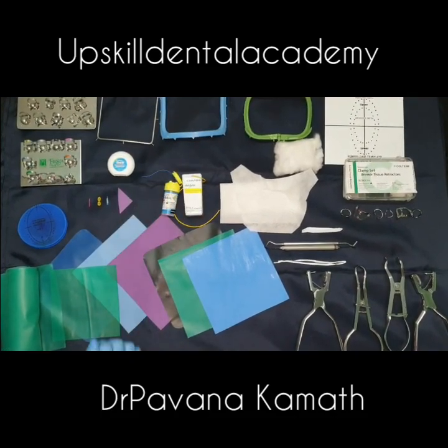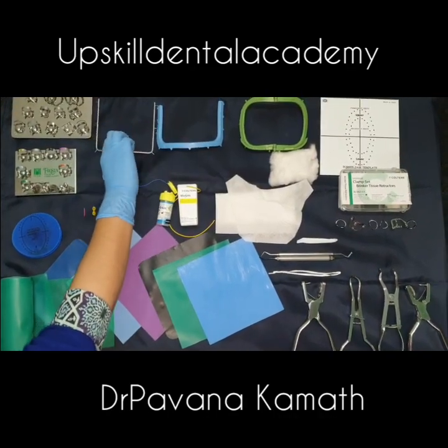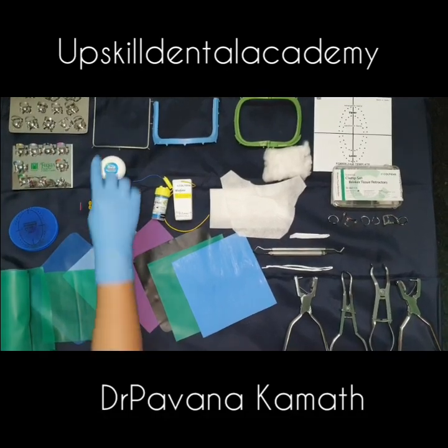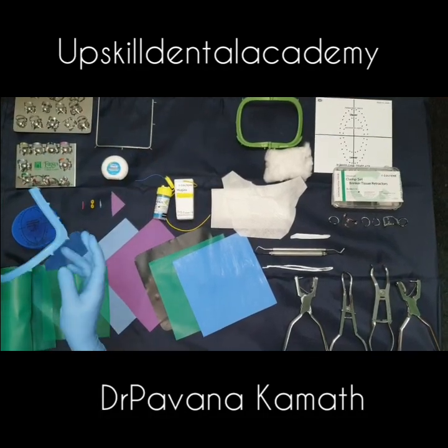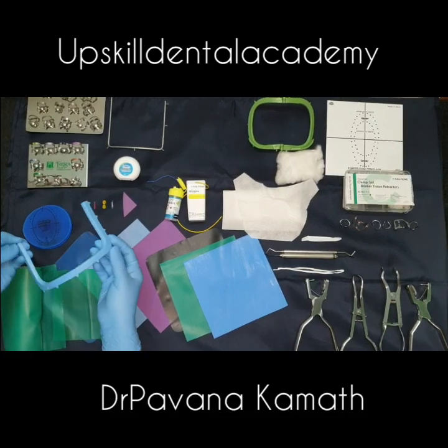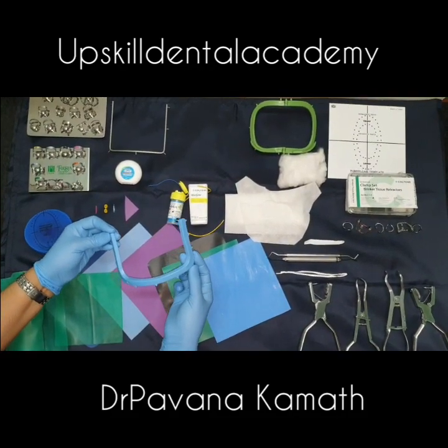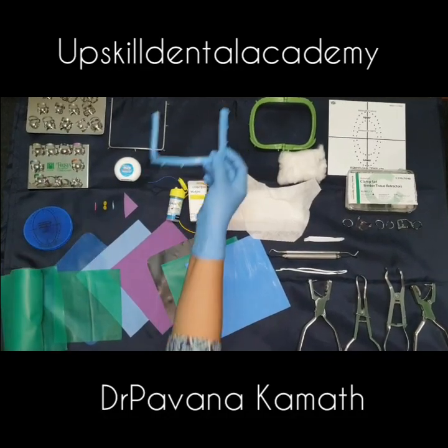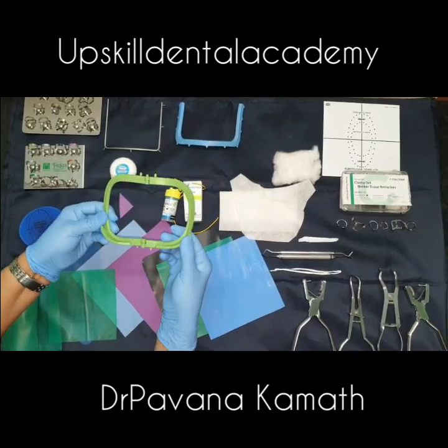Then we have the rubber dam frames. This is the most commonly used metal Young's frame, available in both adult and pediatric sizes. This is a plastic frame, and its advantage is that it does not create radial opacity when used during X-rays. We also have the articulated frame, or foldable frame — the hinged frame.